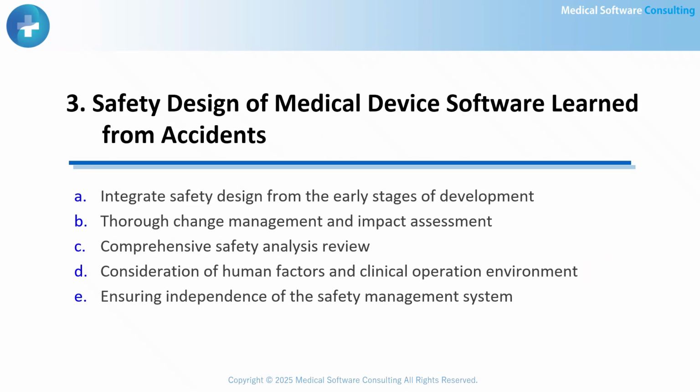From here, we will consider the lessons for safe design of medical device software drawn from these accidents. A. Integrate safety design from the early stages of development. B. Thorough change management and impact assessment. C. Comprehensive safety analysis review. D. Consideration of human factors and clinical operation environment. E. Ensuring independence of the safety management system.